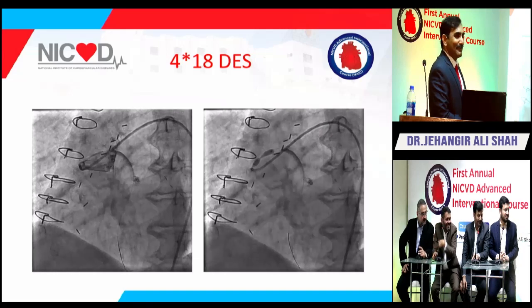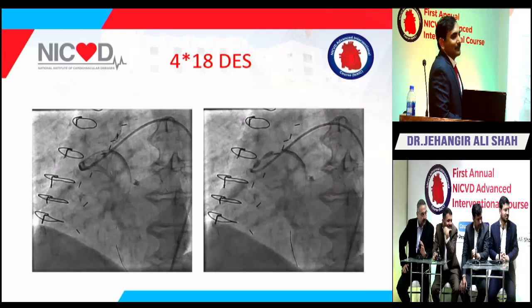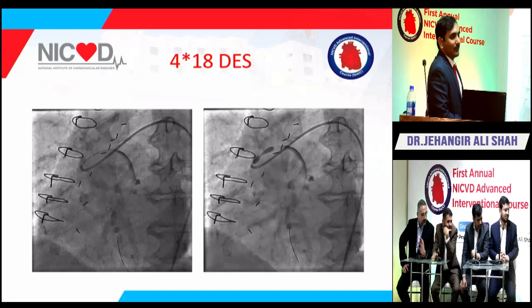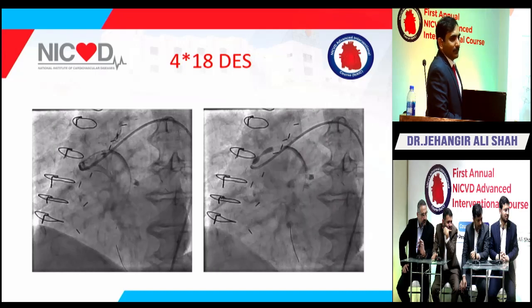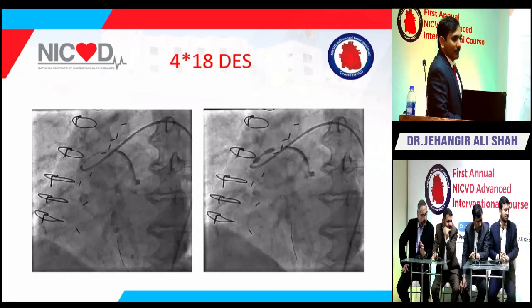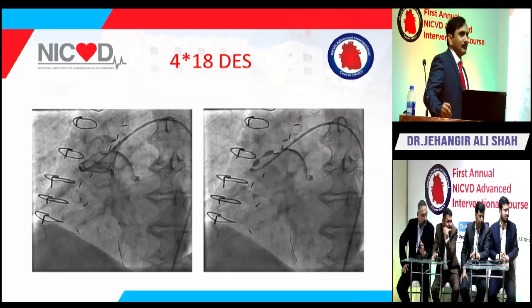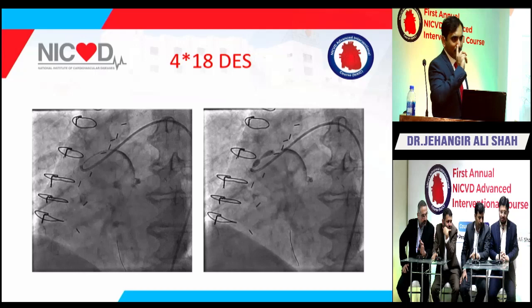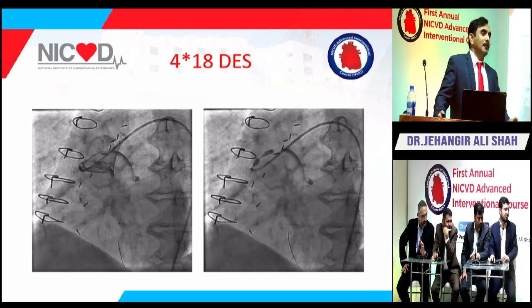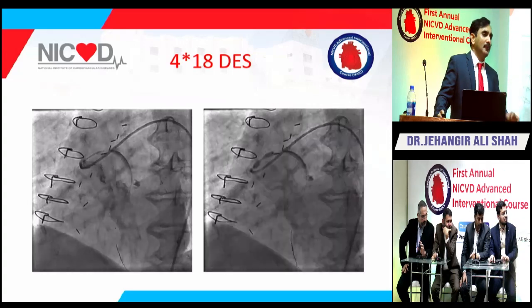So I understand this is a huge challenge. The best way of doing this is to get the guide inside the ostium till the waveform dampens. You pull the stent right to the mouth of the guide, and then you pull both back as one unit. You keep taking small shots, and you're also focusing on the waveform. As soon as the waveform recovers, you pull the stent back another dot. That way, you don't have to see, but physiologically you've proven that you've come out in the aorta.